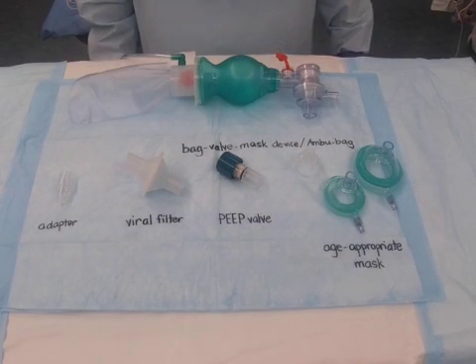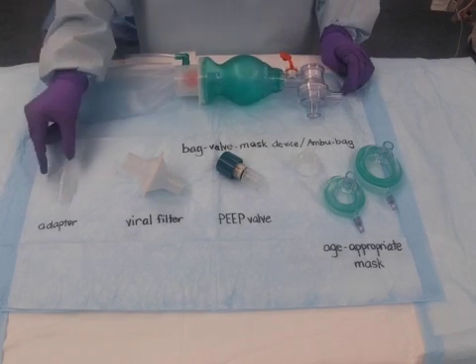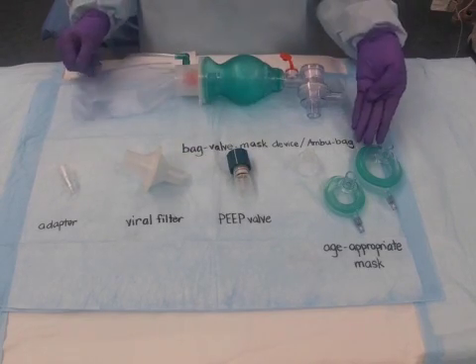To assemble, you will need a self-inflating bag, an adapter, a viral filter, a peep valve, and an age-appropriate mask.